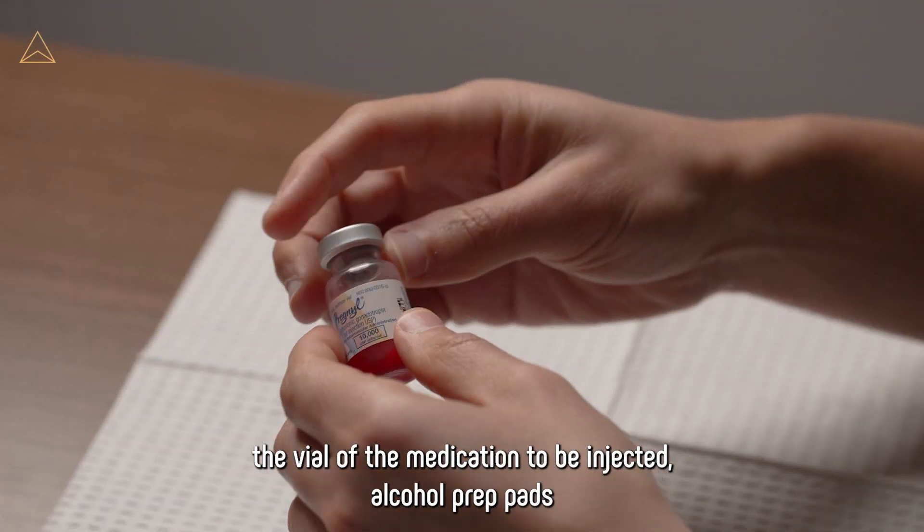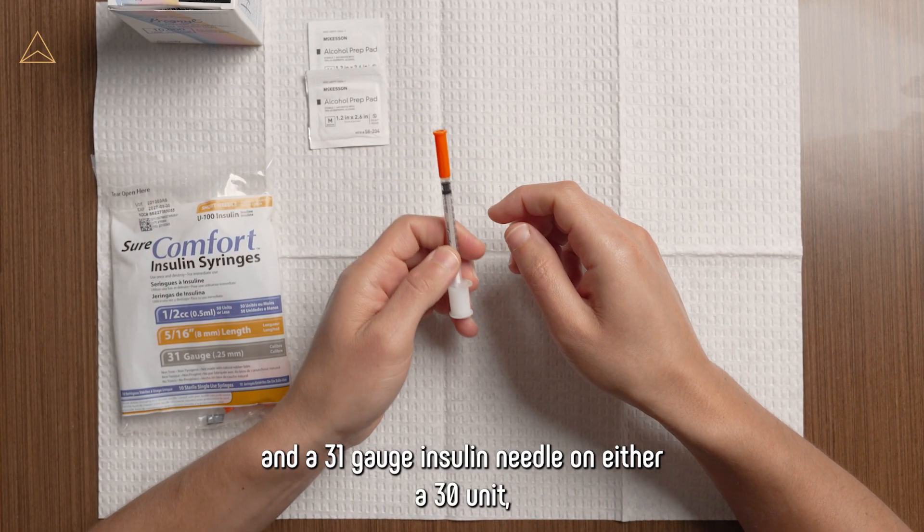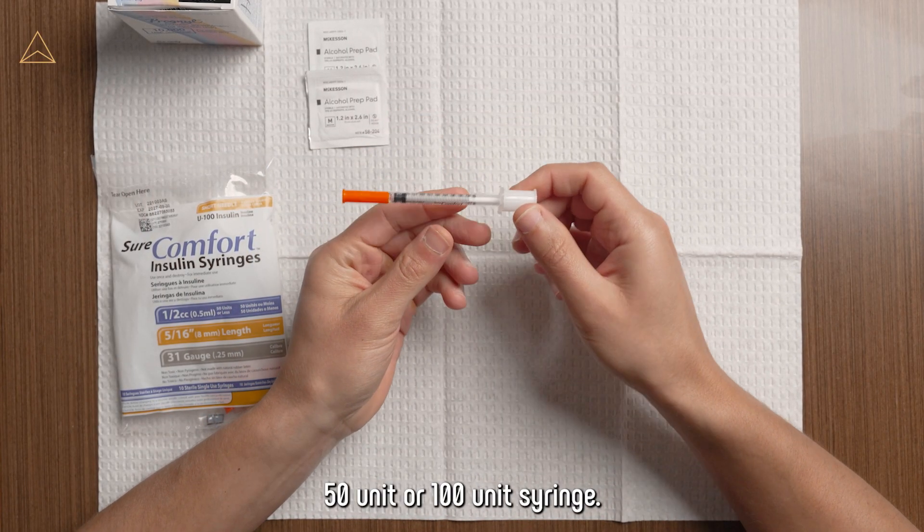The vial of the medication to be injected, alcohol prep pads, and a 31-gauge insulin needle on either a 30-unit, 50-unit, or 100-unit syringe.